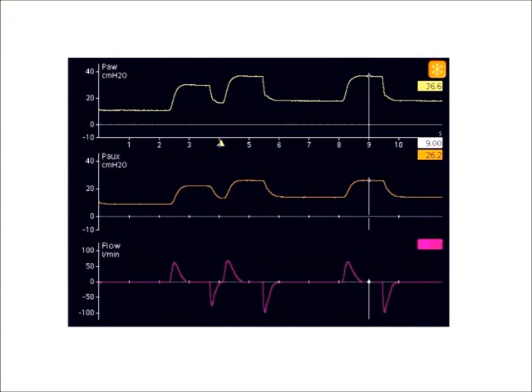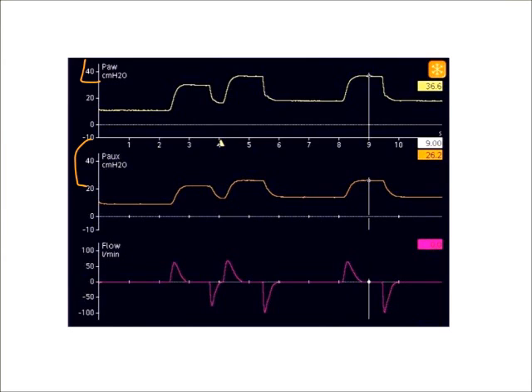You notice I have a peak airway pressure right here and I have auxiliary pressure. That's my PAUX, just an auxiliary pressure. With this pressure line, an esophageal balloon was attached, and I can see what my esophageal pressure is.